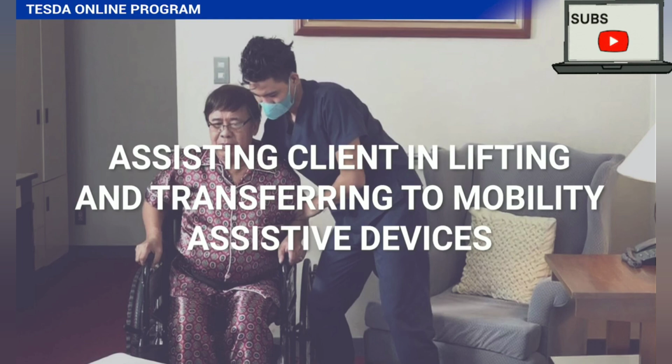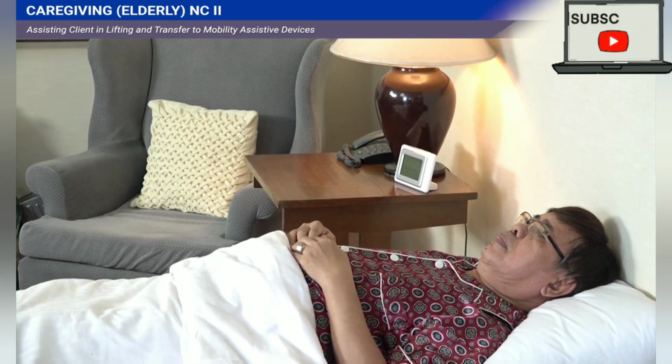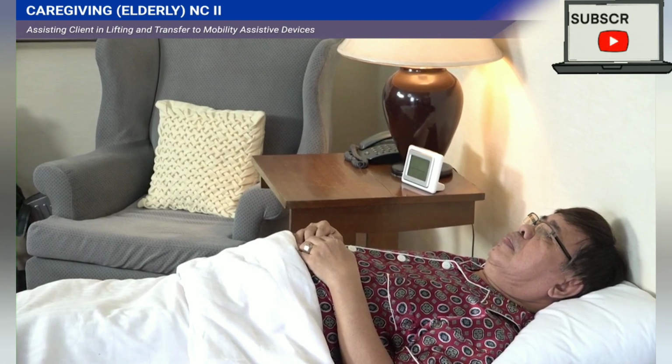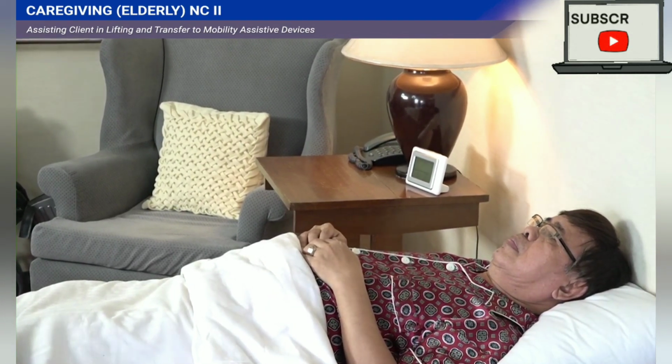Assistive devices. Safety measures and considerations must always be in place when clients lift and transfer themselves from one place to another. To ensure safety during transfer, caregivers can follow this step-by-step guide.